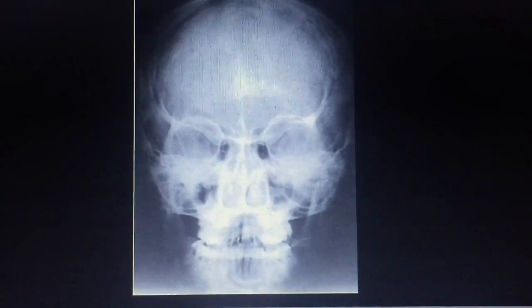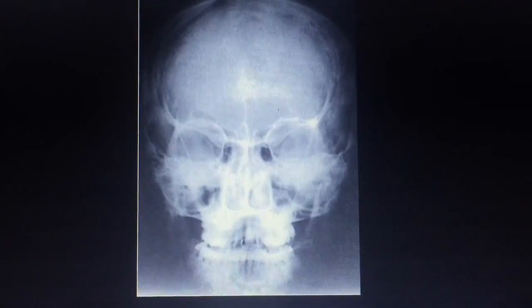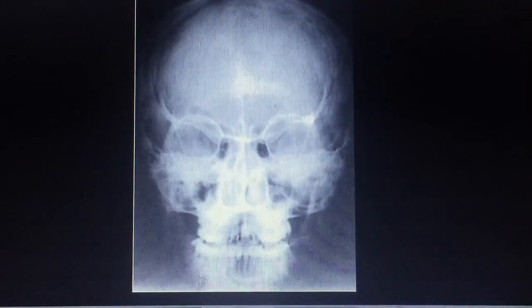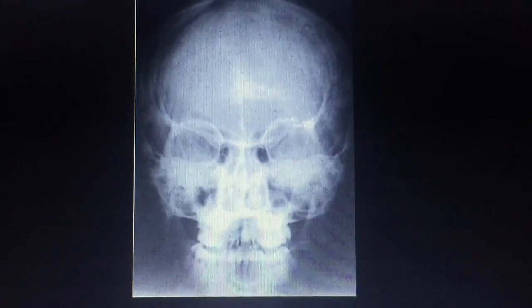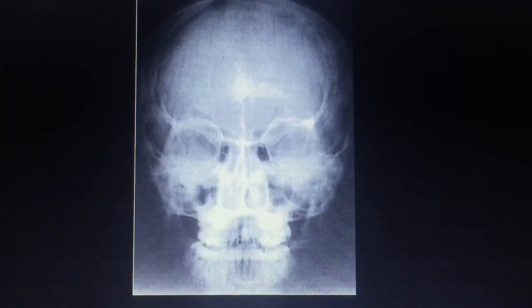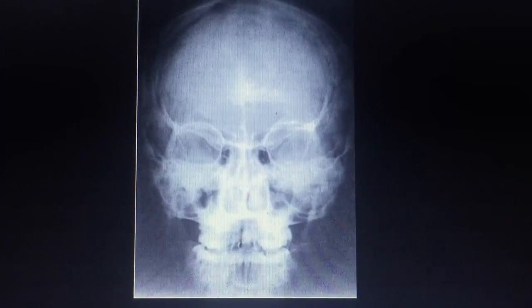Also, the petrous pyramids lying in the lower third of the orbit with a caudal CR angulation of 15 degrees, and filling the orbits with 0 degree central ray angulation. Always making sure that the penetration of the frontal bone is without excessive density at the lateral borders of the skull. Everything is seen in this image and it is deemed okay.